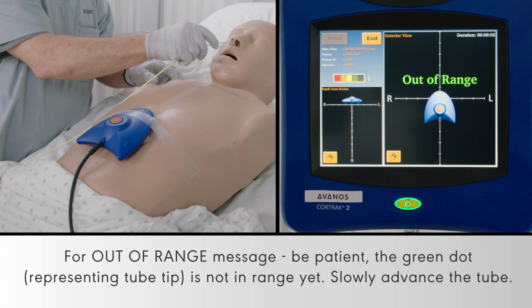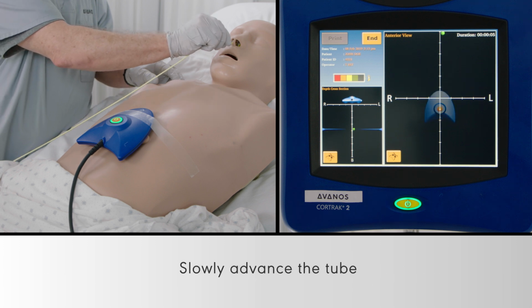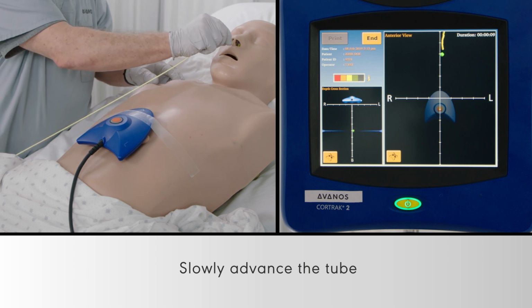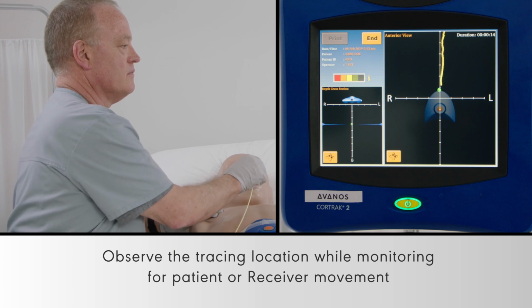If you see an out-of-range message, be patient. The green dot representing the tube tip is not in range yet. Slowly advance the tube. Observe the tracing location while monitoring for patient or receiver movement.